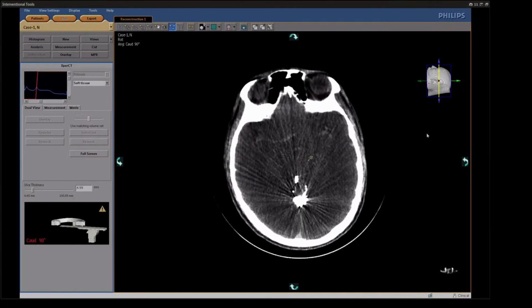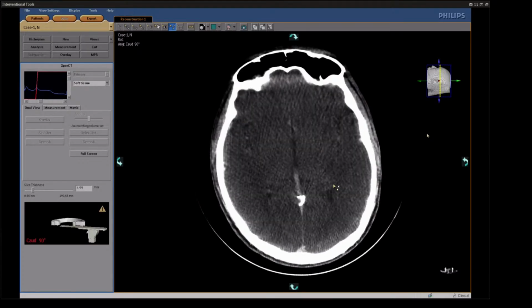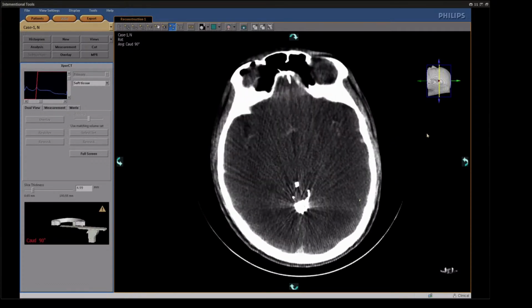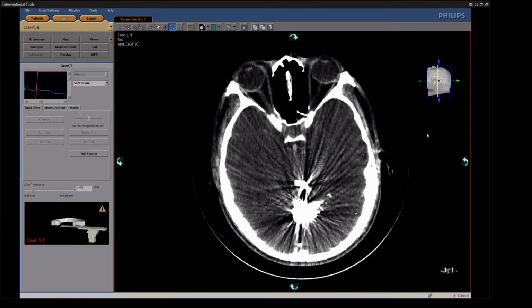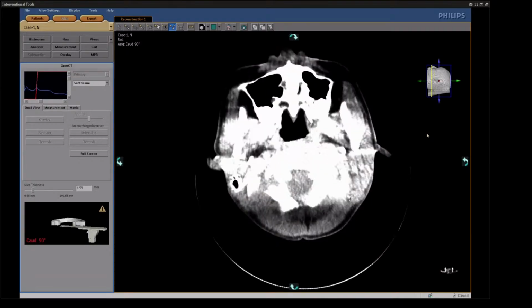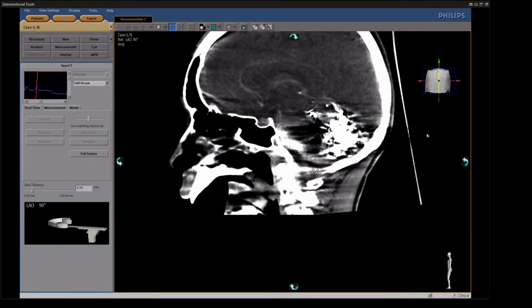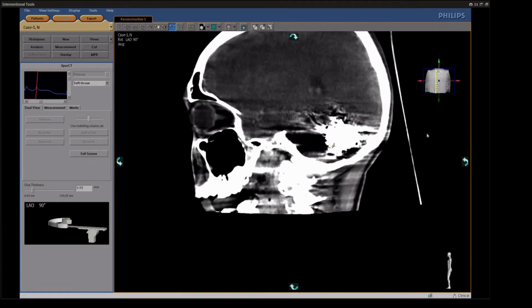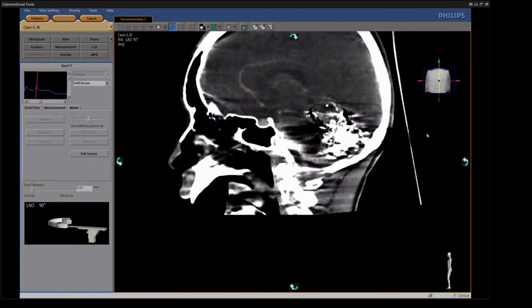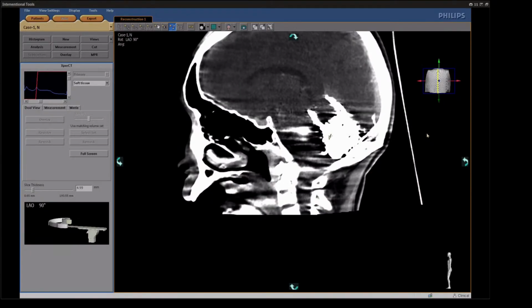Okay, CT is ready. It's a protocol for all intracranial interventions and for severe stenosis in the ICA and vertebral. There is a rule. We finish all cases with the control CT for early control of the complications.